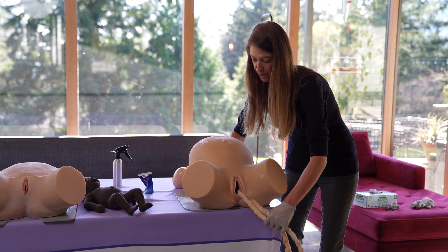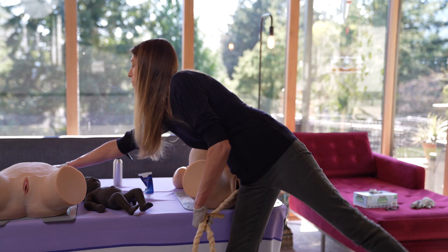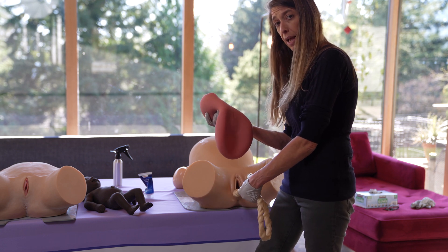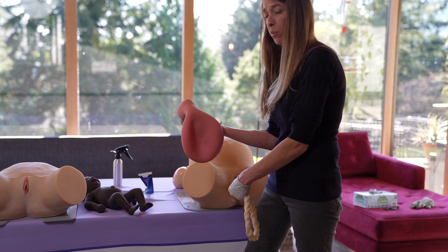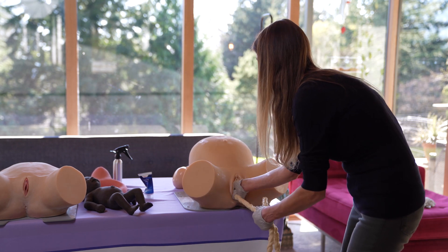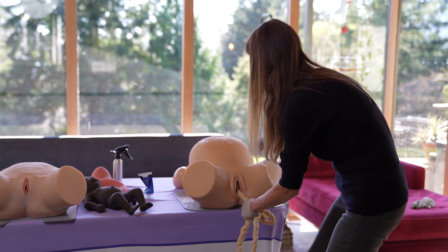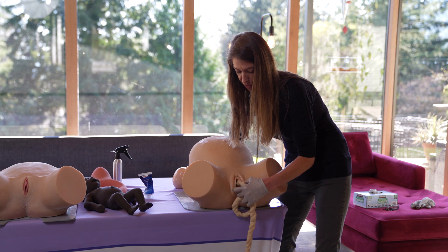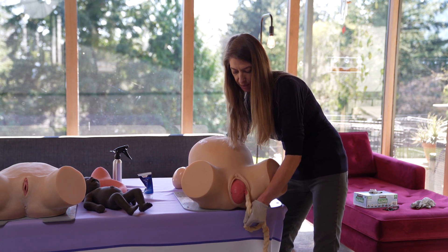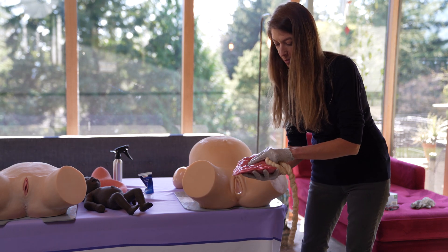The delivery of the placenta is also an option. We have a uterus that can be used to do a separate simulation where you invert it, put the placenta inside, and simulate a manual removal of the placenta. For this demonstration, I'm just giving a little bit of traction to help that placenta deliver. Usually you have someone helping so you're not pulling harder than you would in real life, and you can deliver the placenta and check to make sure.